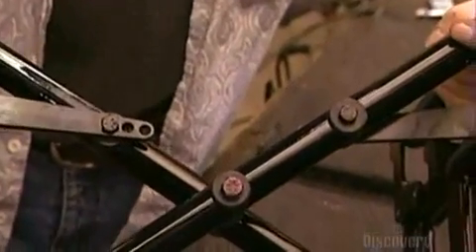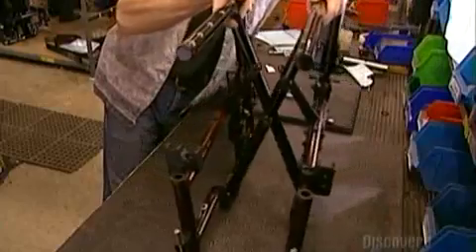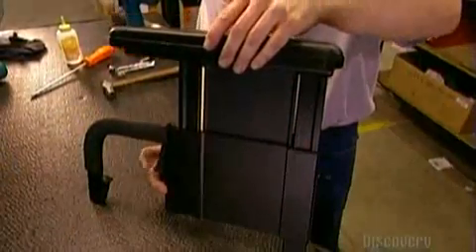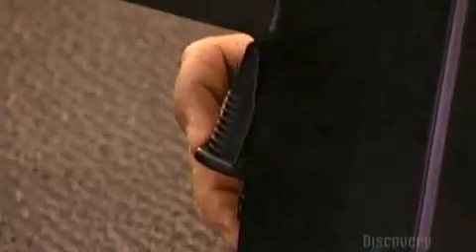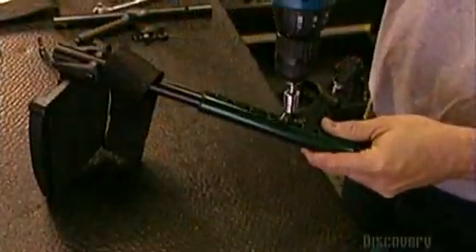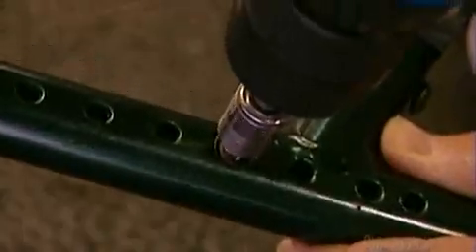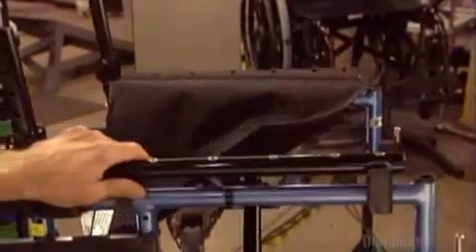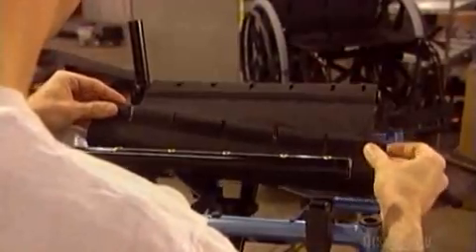They install the rear frame of the wheelchair, then make sure the cross frame folds correctly. Workers test the height adjustment lever for the armrest. Then they install a removable aluminum footrest, setting it to the desired length. It has a heel loop to prevent the user's foot from slipping off. The chair has a foldable sling seat. It's made of nylon and attaches to the frame with 6 screws on both sides.